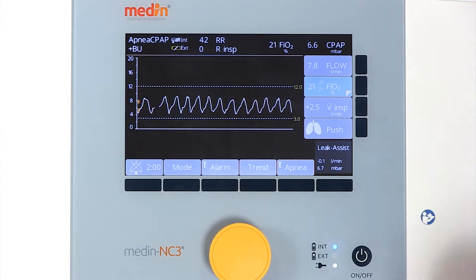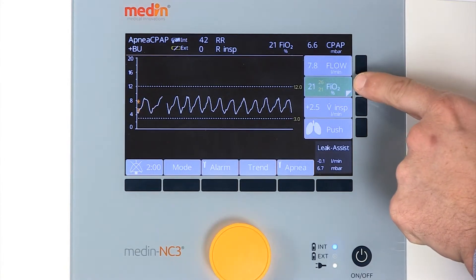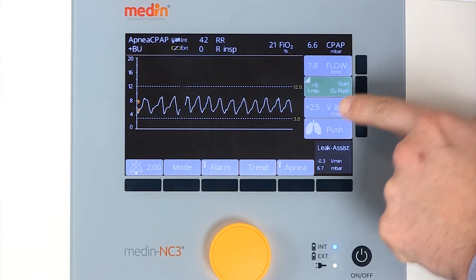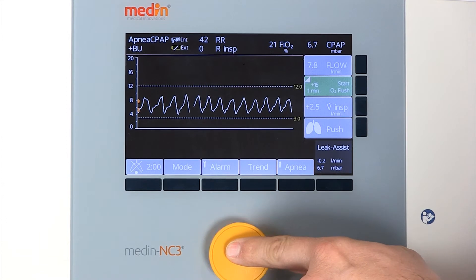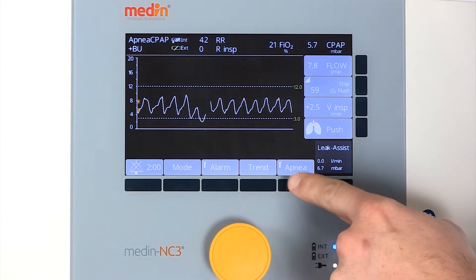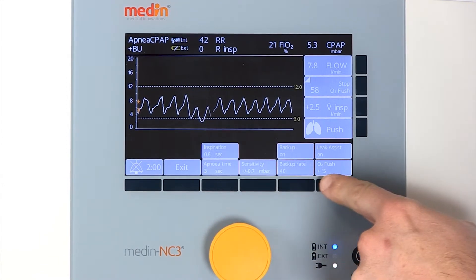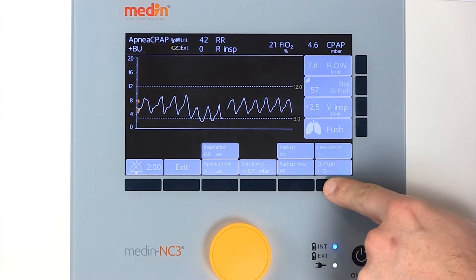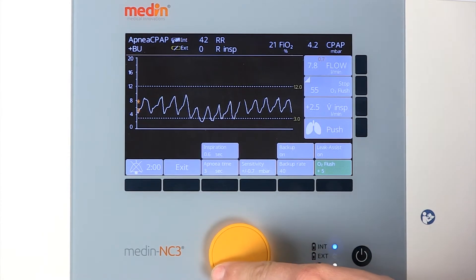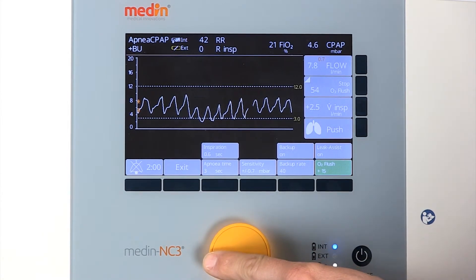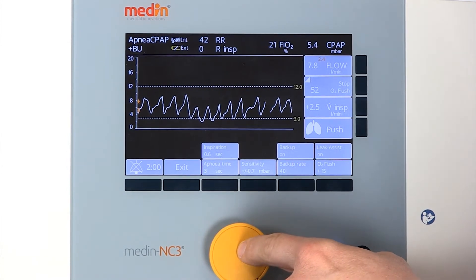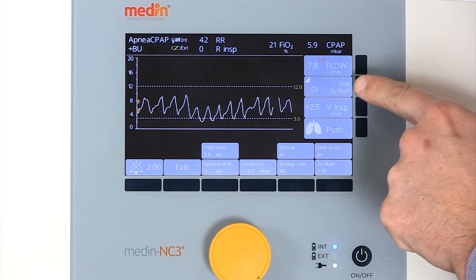Oxygen and the oxygen flush can be set manually. The range of oxygen for the oxygen flush can be set between plus 5, plus 10, and plus 15% above the current FiO2.